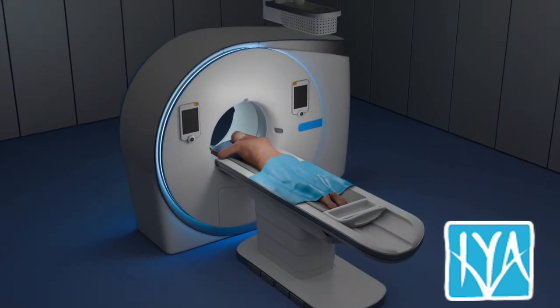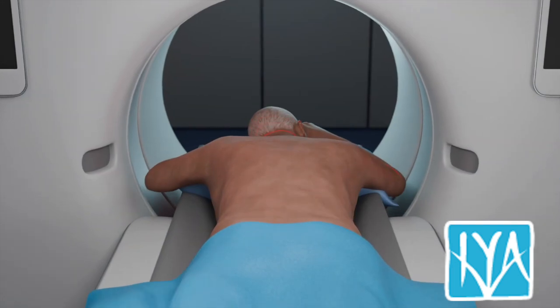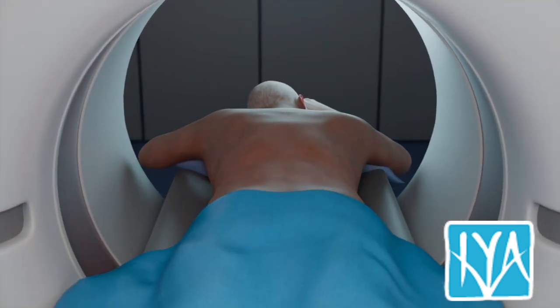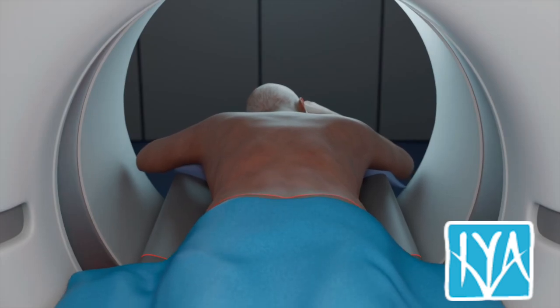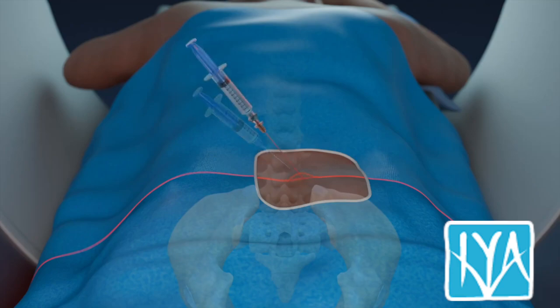CT guidance provides superior precision for deep or complex bone marrow biopsy sites. A preliminary CT scan is performed to identify the exact biopsy location and determine the safest needle trajectory. The skin and periosteum are anesthetized with local anesthesia.